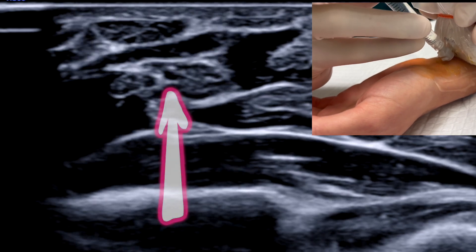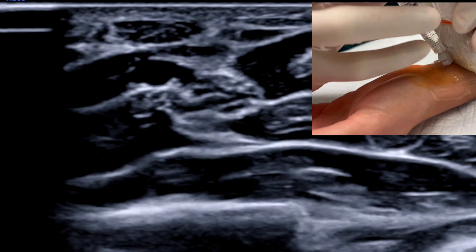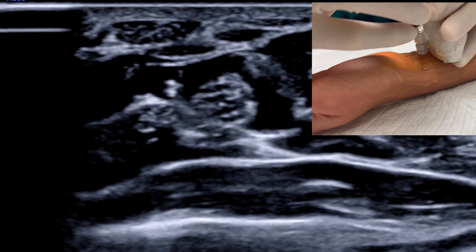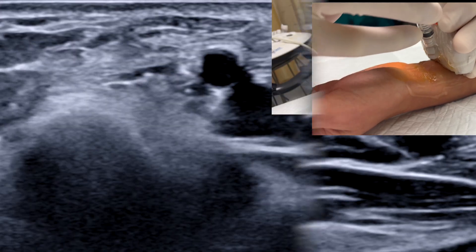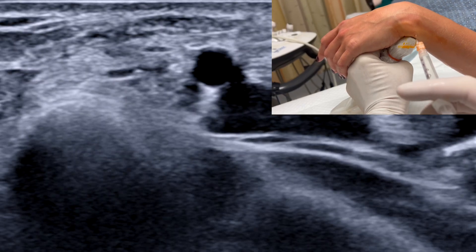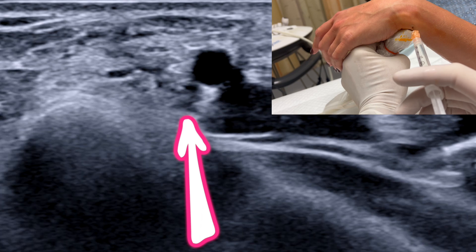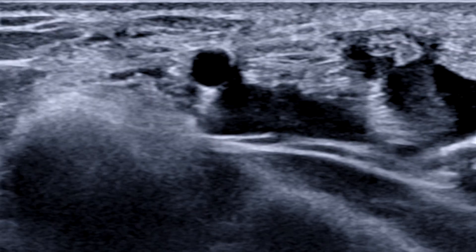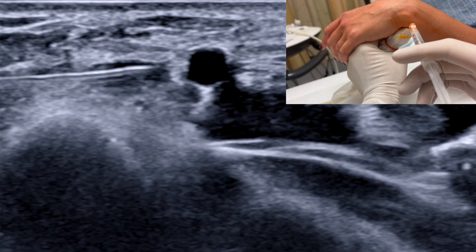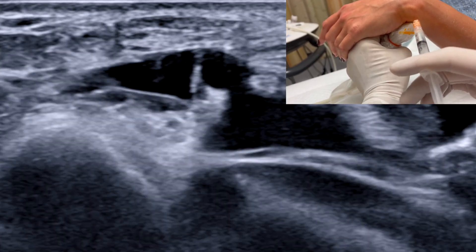After sterile skin prep, a 27 gauge needle is inserted out of plane with frequent small pulses of local anesthetic until spread is visualized around the median nerve. A total of three mils is all that's necessary. For the ulnar nerve, we find it helpful to drape the hand over the ultrasound probe, which is held vertically. An assistant can help stabilize the hand and fingers. The ulnar nerve is just medial to the ulnar artery. A 27 gauge needle is passed in plane and hydrodissection used to peel the nerve off the artery. Again, a total of three mils of local is more than sufficient.